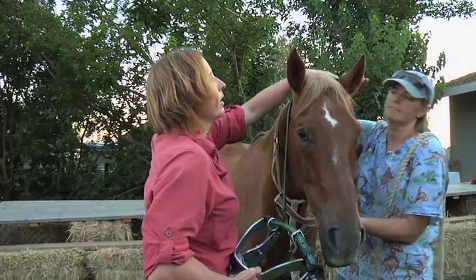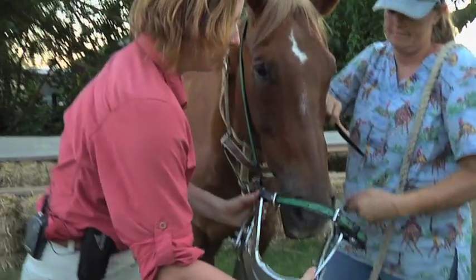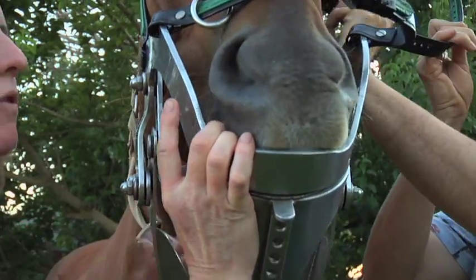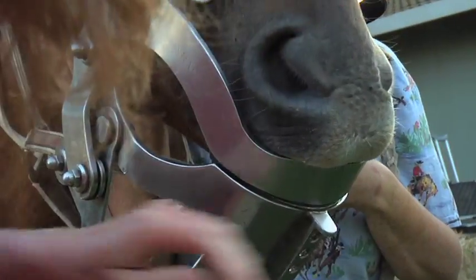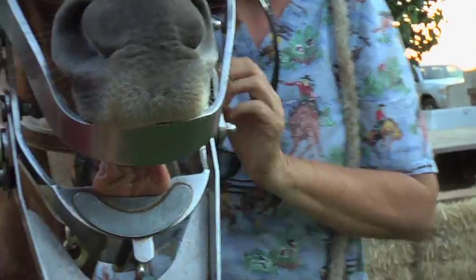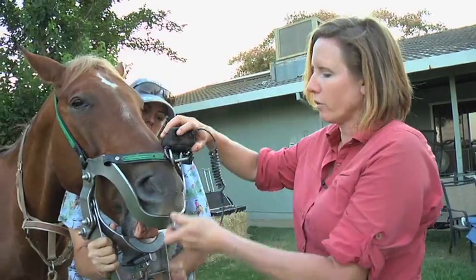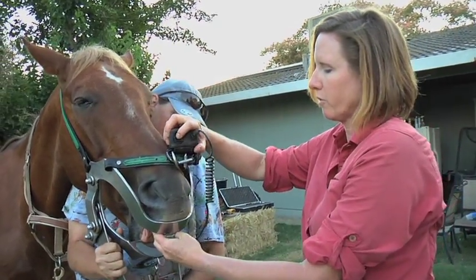In order to get a good look inside a horse's mouth, you need to use what's known as a full mouth speculum. The type of speculum used varies depending on the preference of the veterinarian. What a speculum does is allow us to open the horse's mouth and hold it open. It's also important to have a good light source to really get a good look inside the horse's mouth.